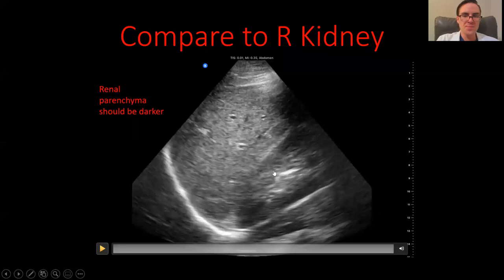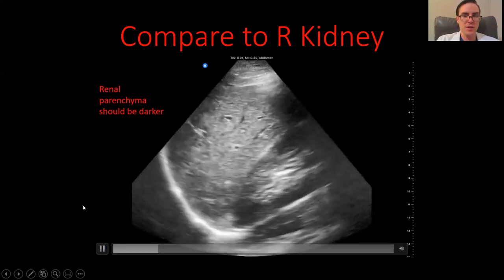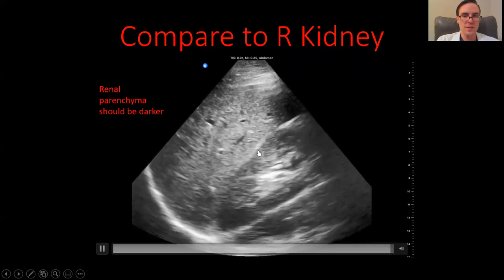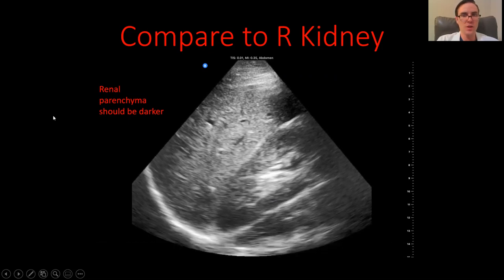There's the kidney again. As you can see, the liver looks lighter than the parenchyma of the kidney — or this dark ring around the kidney — and that's as it should be. The kidney is being pushed more into view here, giving an even better view of the normal liver architecture. That's what it should look like.